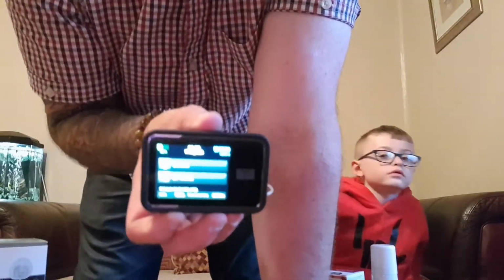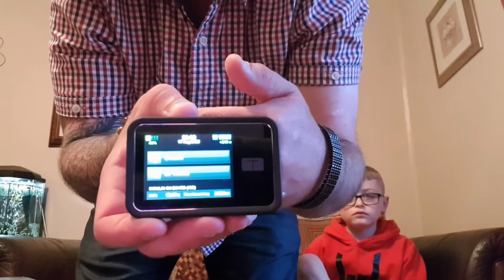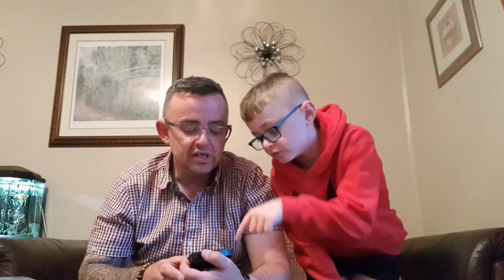I click the top button. I've got 12 units of insulin. It tells you what the date is. Can you see that? I don't know whether it's going to focus. Home video at its best. No, it's not going to focus. Sorry about that, but it's telling me that I've got 12.17 units of insulin on board, and the time remaining is 3.5 hours for that to go through. So that's us done.